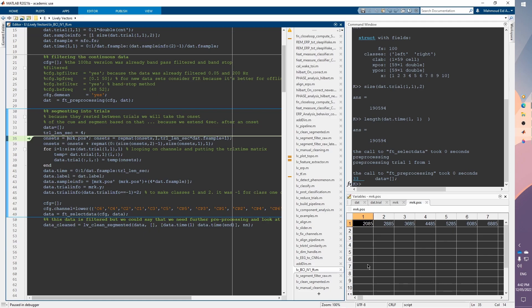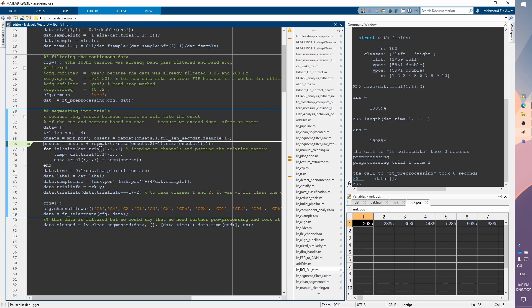The trick here is that I'm repeating this matrix so that the first element is this onset value, then I repeat that value across each column. I'm creating a matrix with all the indices so that I can access my continuous data once with the needed indices and execute everything at once. If I execute this, it will create a 200-by-401 structure because we get 200 trials.